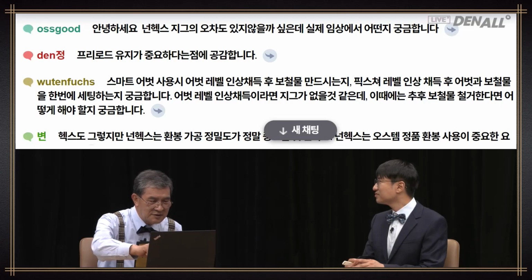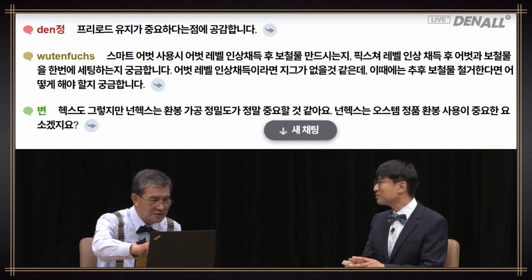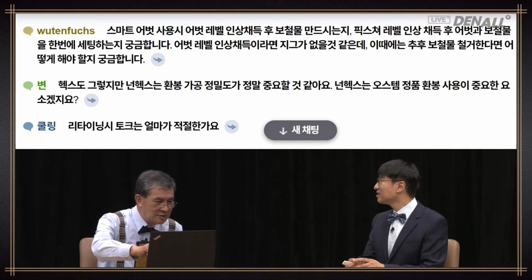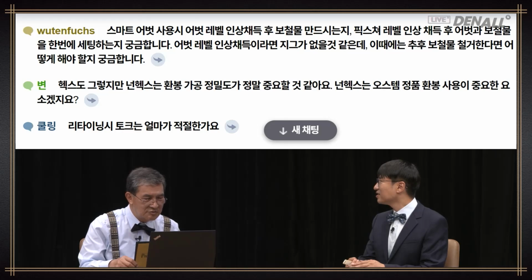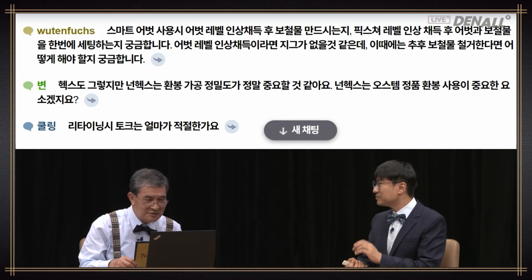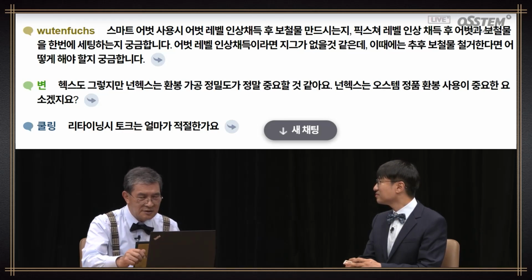What is your clinical experience? If you take an abutment level impression, then this will solve the problem. If you use a smart abutment after taking an abutment level impression, do you make the prosthesis then? Or do you take an implant level impression and set the abutment and prosthesis at the same time? Abutment level impression taking. In this case, you would not need the jig.